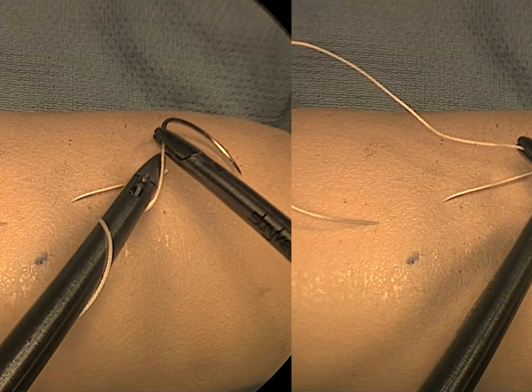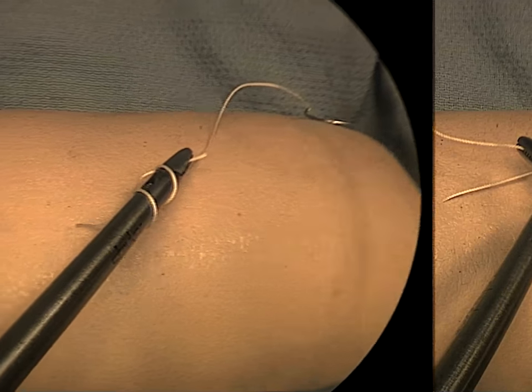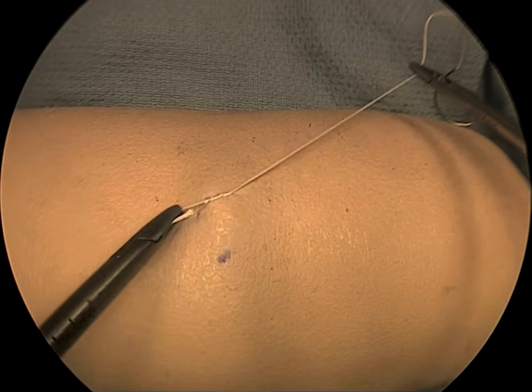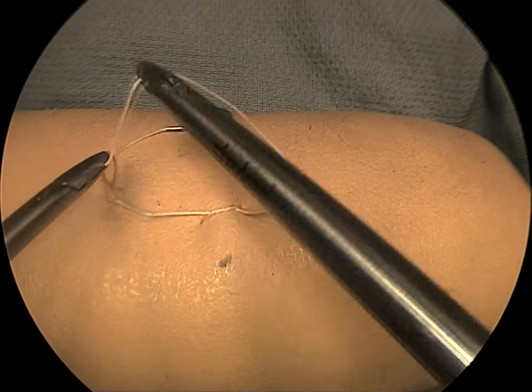With instrument angles equal to or greater than the suture angle, the double wind is easily accomplished, and for the second throw, a suture angle is set almost equal to the instrument angle.